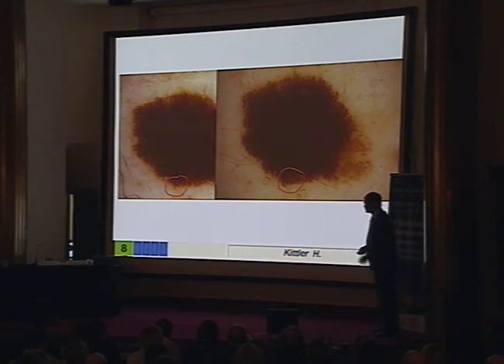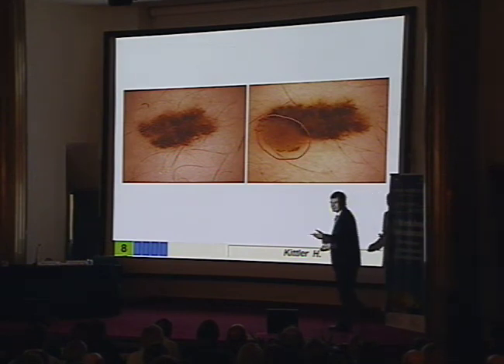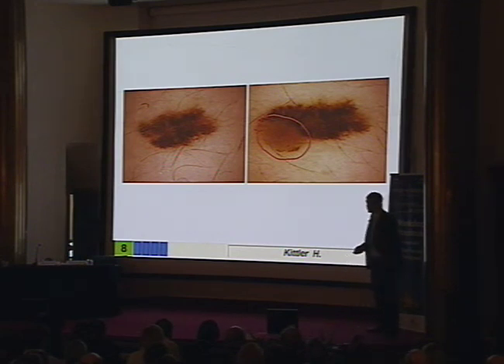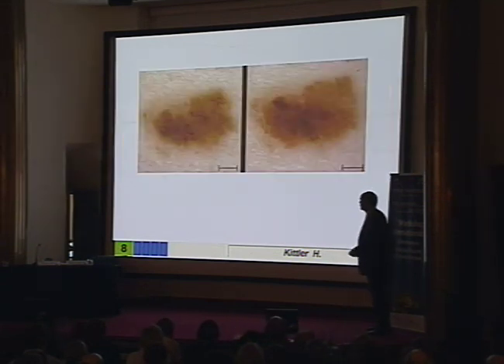You see the difference? Here you can see a reticular lesion, and then a nodule appears. Unfortunately, this patient waited 3 years to come back. This shouldn't happen. Usually we tell the patients to come back after 3 or 6 months, not after 3 years. But the patients sometimes do what they want, not what you want.